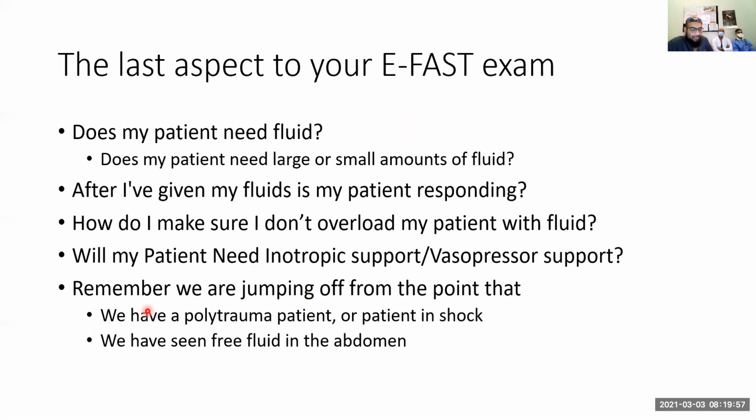So we are starting from the point of view that we have a polytrauma patient in shock. We have seen free fluid in the abdomen or even the chest. That's where we're starting from, so ultrasound comes in really handy. What do you think we would use to monitor volume? Just a question, what would you use? Let's say you didn't have an ultrasound. What would you use to check your patient's volume response?